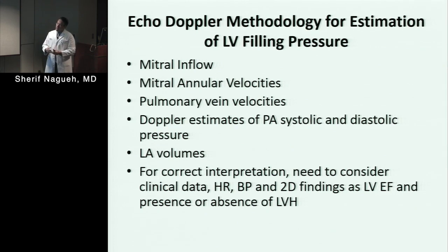The problem with the filling indices is they are exactly what they are: filling indices. And filling depends not just on the pressure of the left atrium, but also on LV diastolic function. So someone can have impaired relaxation but elevated LAP and have normal filling indices. Without that hemodynamic piece of information, if you're just presented with a normal filling rate in early diastole, you cannot draw reliable conclusions about diastolic function.